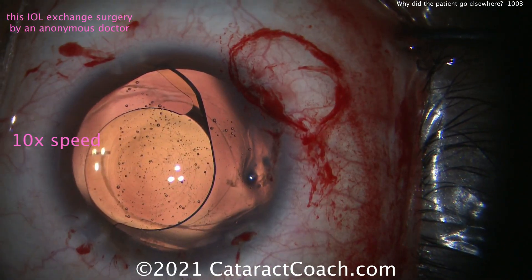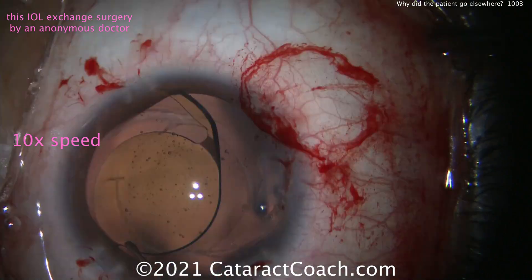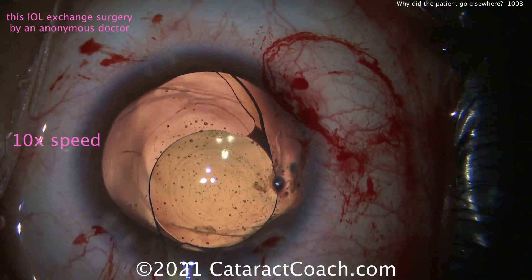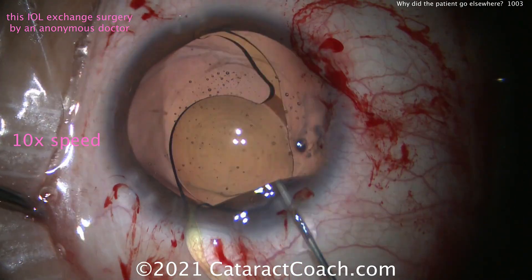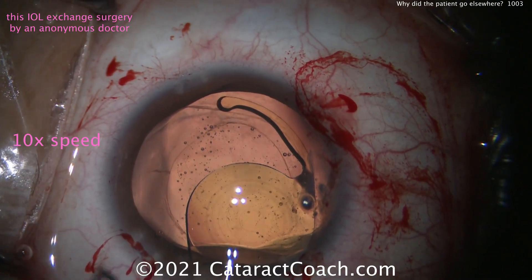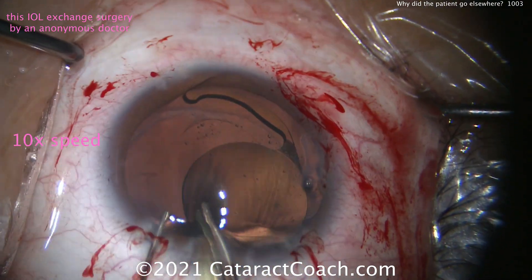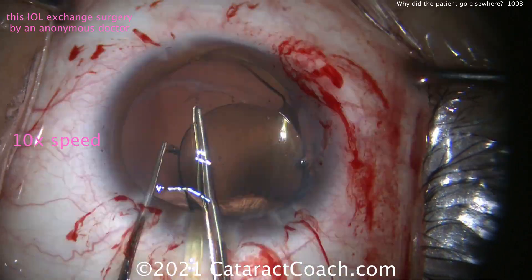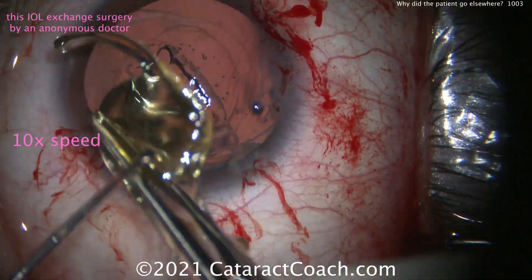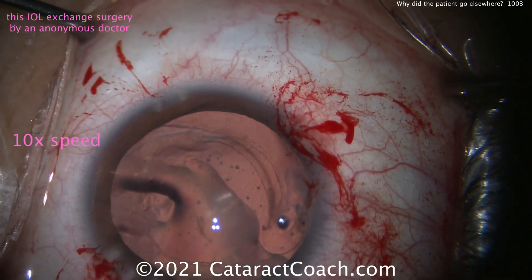He's creating a big temporal incision, probably about three millimeters wide. There's that lens coming up. I also sent this surgeon a link on how to do our favorite twist-and-out technique to explant the lens. So he's going to do that — beautiful. There's grabbing the edge of the optic, here comes a spatula going over, and there's the lens outside the eye. Beautiful.